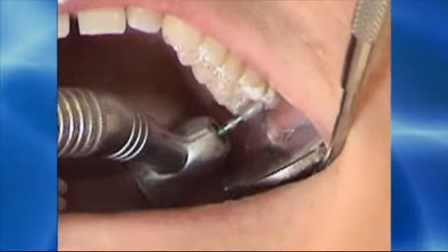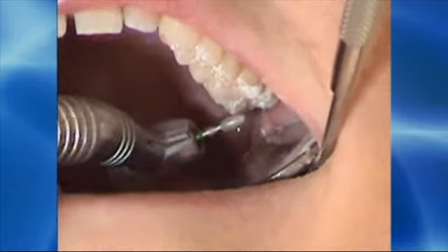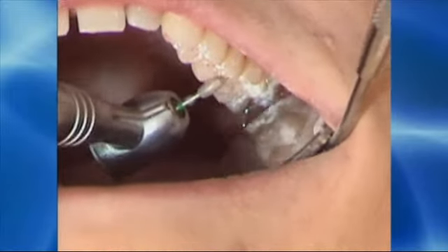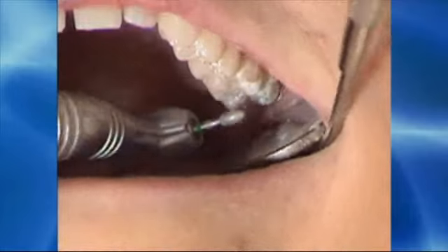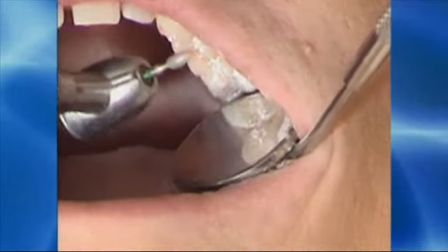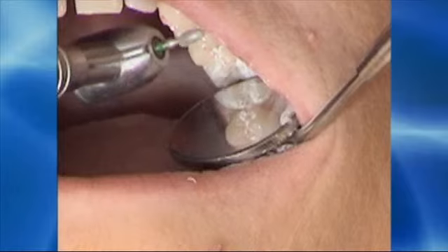I'm just touching the teeth, removing small lace-like marks that the T-scan shows to be long disclusion time. And for some of you that may be an adjustment in your own thought process, because a lot of the marks that we're treating are very small, lace-like, and scratch-like.